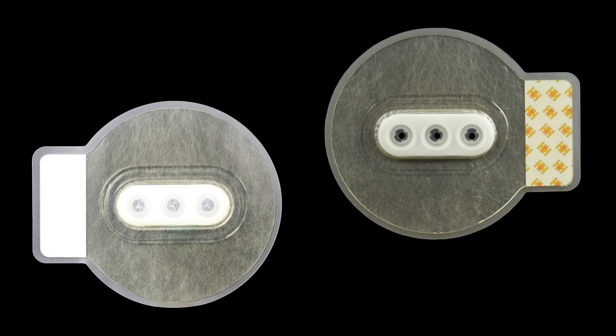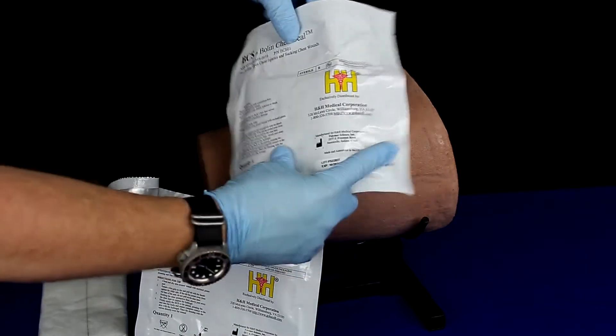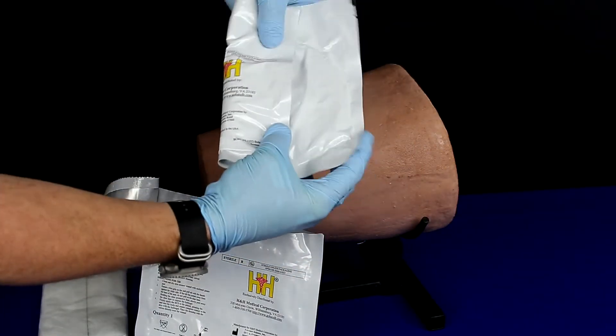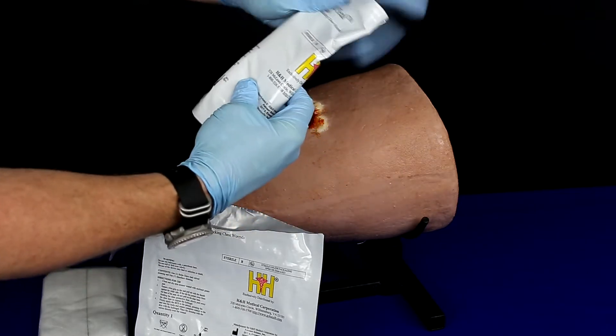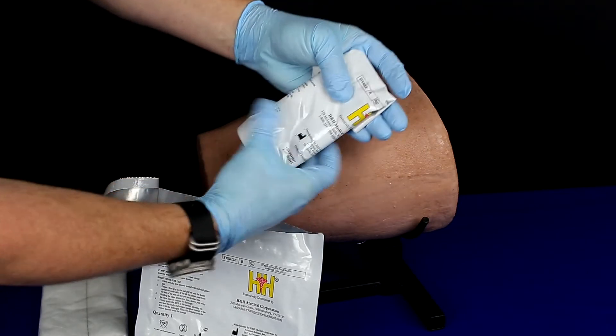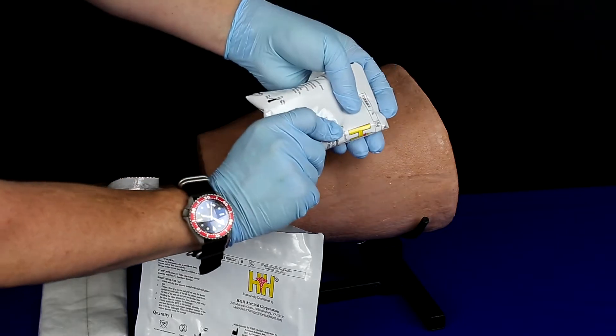The rugged polyurethane structure of the BCS ensures that the seal will function in harsh field environments and allows for easy application without wrinkling. The BCS can be rolled or folded to fit into a medical pack.